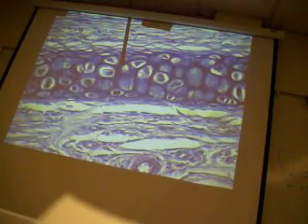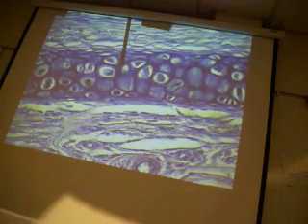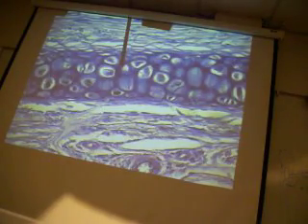This is a longitudinal section. If you think about things that are flexible and stretchy and bounce back, think about when mom used to grab you by your ear. When she lets go of it, notice how it bounces back. It doesn't stay in that position. Well, it's because of this cartilage right there. Some of you may give your dog a pig's ear. Anybody give their dog pig ears? That's that stuff right there, except when you give it to them, it's dried up. Everybody feel pretty comfortable with that one?